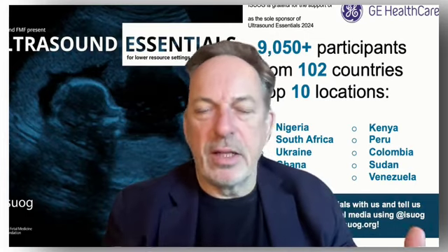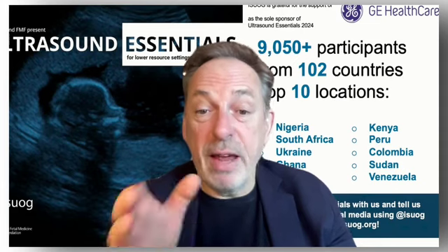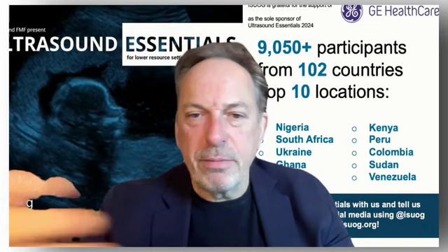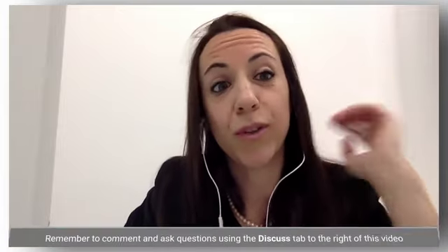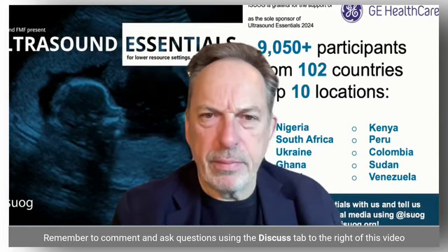So do you think, as a discipline, when you started learning, it's important to look at all these structures for every scan you do, because that's the only way? How did you create your experience, if you like? Yeah, I agree. First of all, it's important to know the pelvic anatomy. I spent some time with Professor Curley and the other surgeons to better understand. But it's quite easy, really, to assess the septum because the transvaginal is a dynamic examination, but also the ligaments.